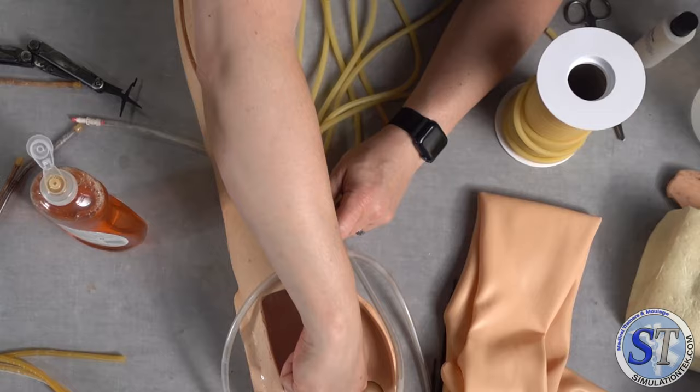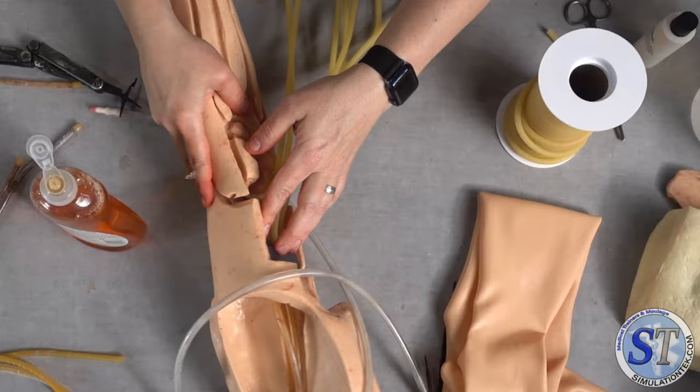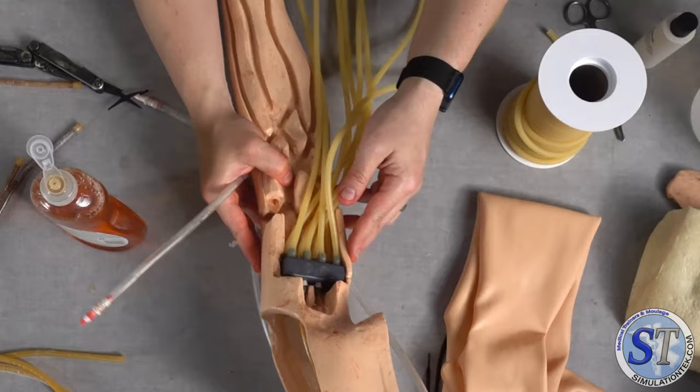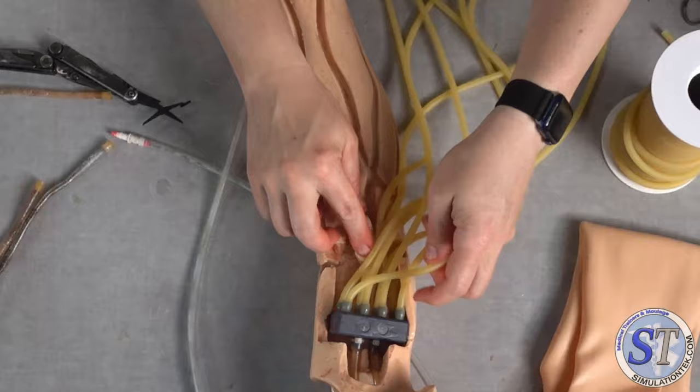Okay, so we got all those tubes in, and we are going to set that back in the way it's supposed to be, which appears to be like that. Manifold like that. And then we're going to put the tubes back in. This is going to be trial and error because I'm not stopping the video to investigate right away. We're just going to work with it and see what tubes I can get to go where. I'm going to start with the lower tubes because those are in my way.